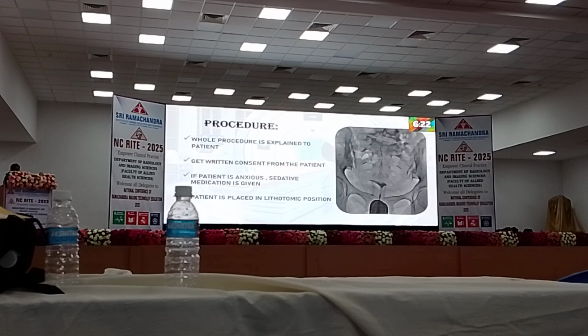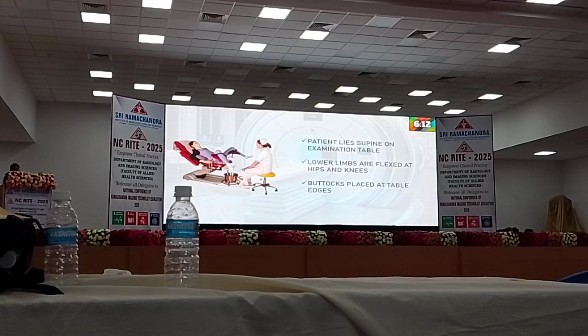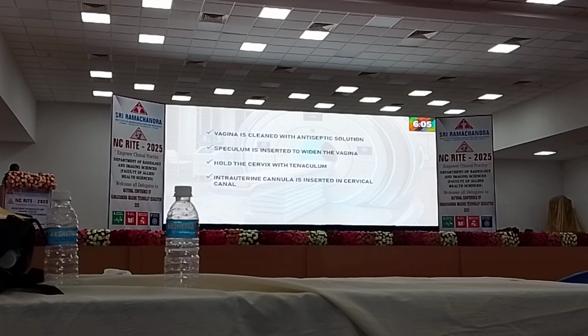The procedure should be explained to the patient beforehand and written consent obtained from the patient. Sedative medications are given if necessary, and the patient is placed in the lithotomy position. The lithotomy position is where the patient lies supine on the examination table and the lower limbs are flexed at the hip and knees. The buttocks are placed at the table edge.